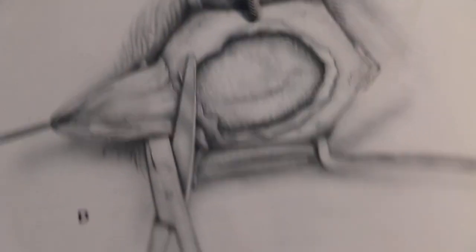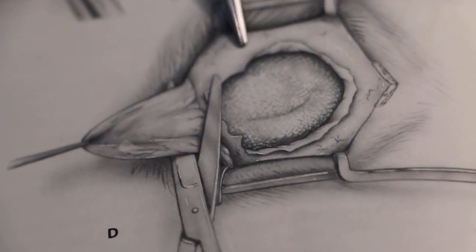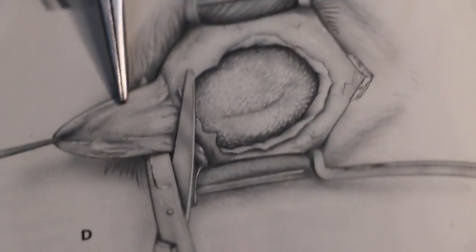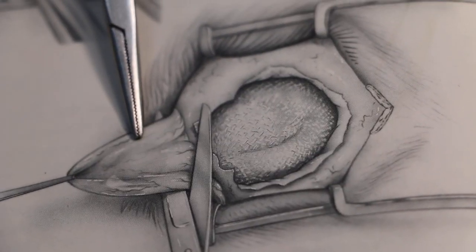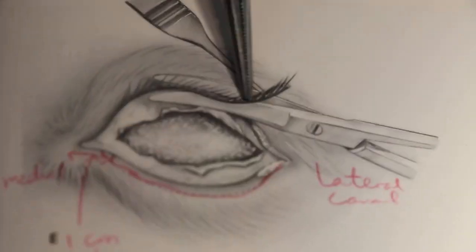The next step is to find the third eyelid. I use electrosurgery to cut it off. In the end, we are left with this opening where the eyeball used to be.